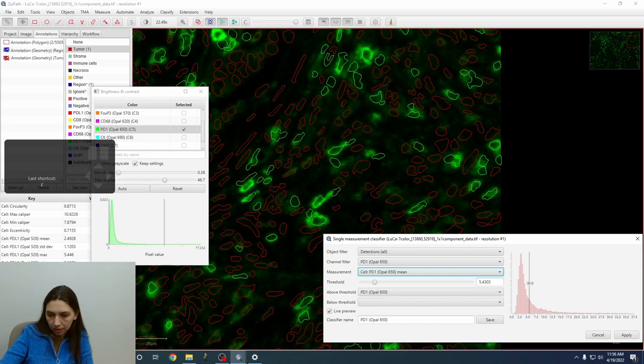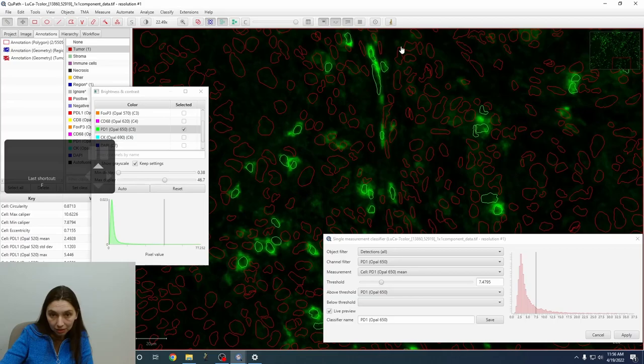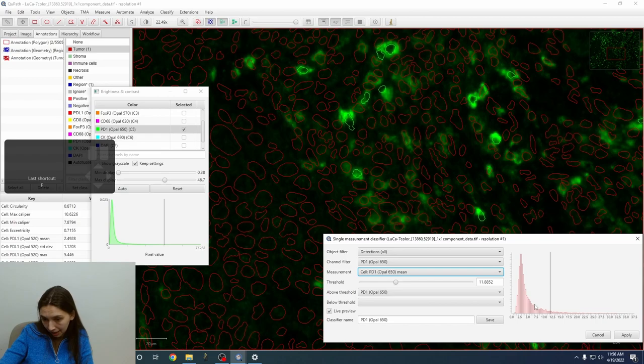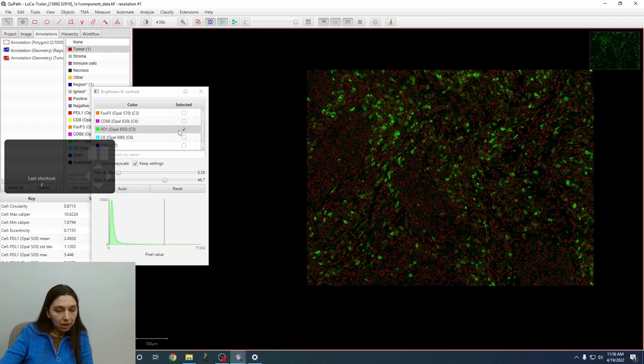Okay. I'm going to do this one fast because you don't need to watch me evaluate an arbitrary threshold in my head, but let's call it here. In general, if you see a shape like this where it goes down and then there's a little bump and then it goes down again, that means there's two distributions overlapping, and right in the middle there is usually the correct threshold. Okay. So we've made three classifiers.